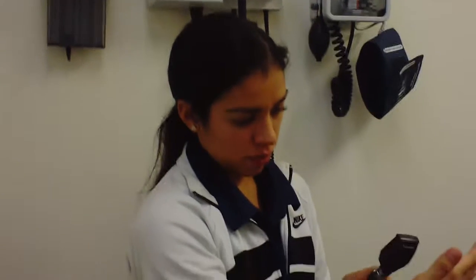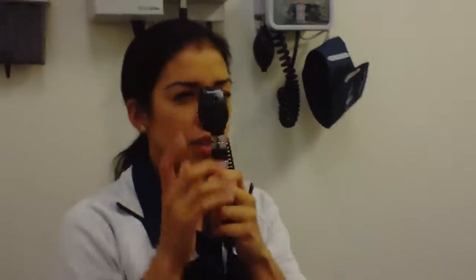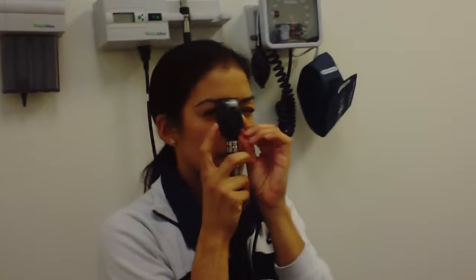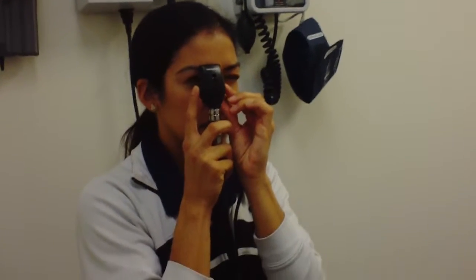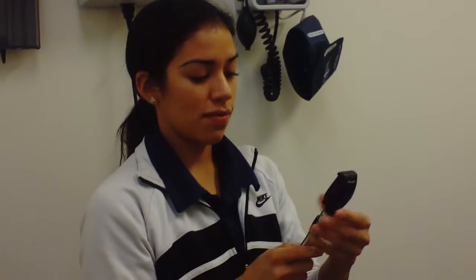Now I'm going to go into infinite focal length. I need to turn down the light intensity to low, go back to 0. This time, I'm not going to look at the back of my hand. I'm going to look at something in the room. I'm going to look at those numbers and see what my infinite focal length would be. I see very clear numbers with, again, a number 3 for my infinite focal length.